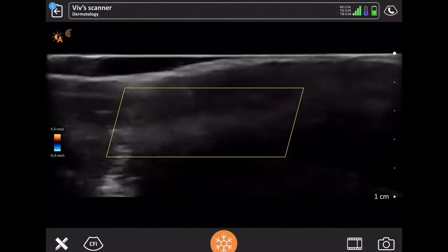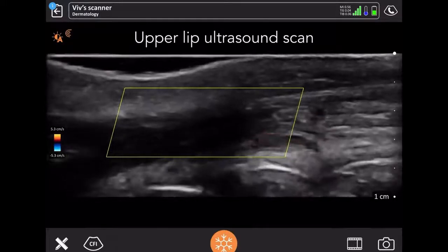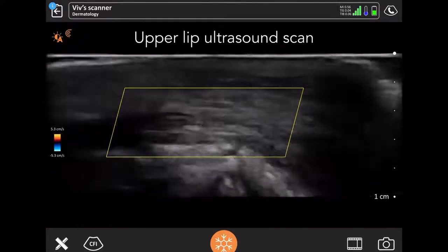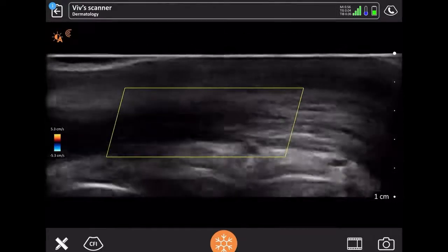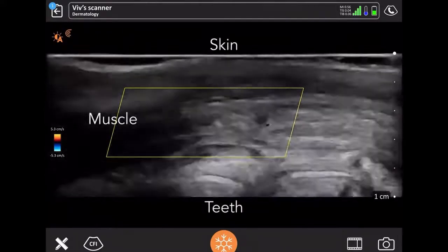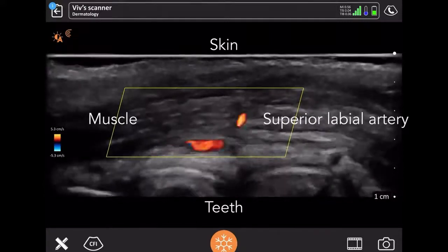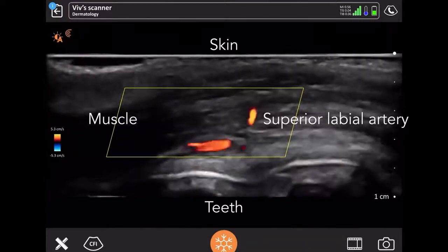So here I'm running the scanner across my top lip. I was trying to see the main vessel just in the top lip area, and you'll see some descriptions of what you're actually looking at in a second. The teeth are at the bottom of the scan. You'll see them in a second. It's just the white areas. The top of the scan is the skin at the top of my lip, and below that there's muscle and there's blood flow deeper down in my particular case.